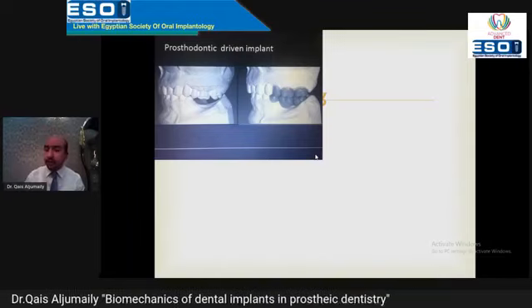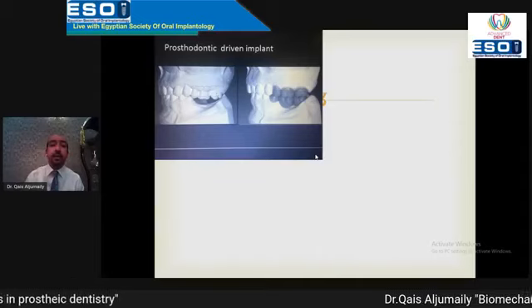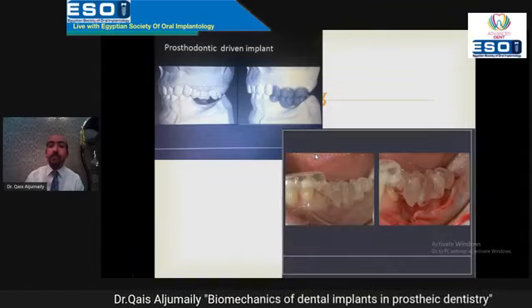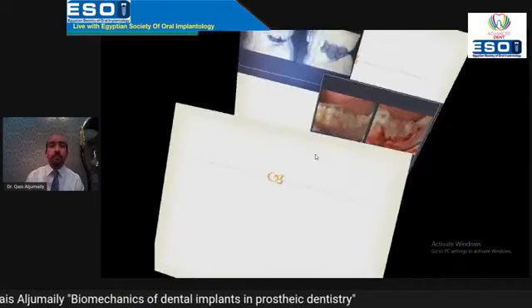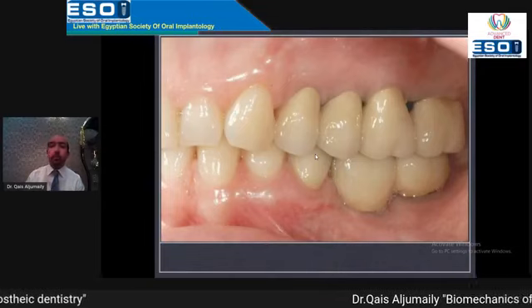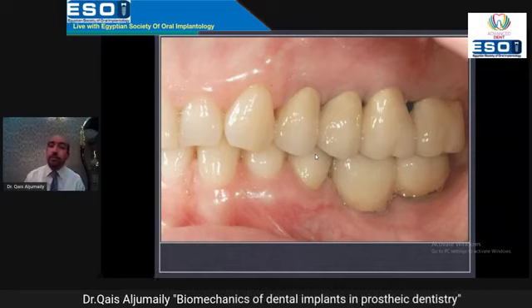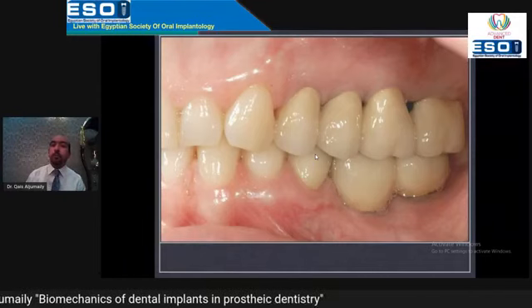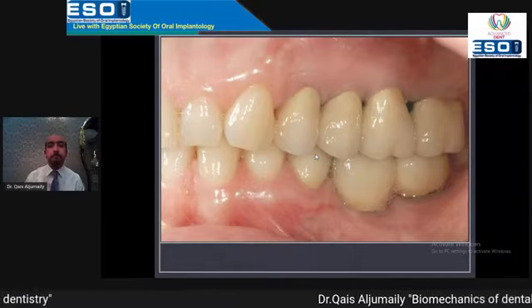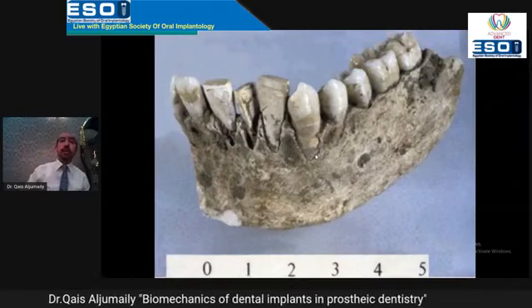So here, after making this diagnostic cast and making our study for this case, the treatment plan is crowning of the upper teeth, cutting a lot from the occlusal surface, and making crown lengthening gingivally or apically to provide more space with the lower ridge to make the dental implant. So this is one of the cases that we might face when doing dental implants.